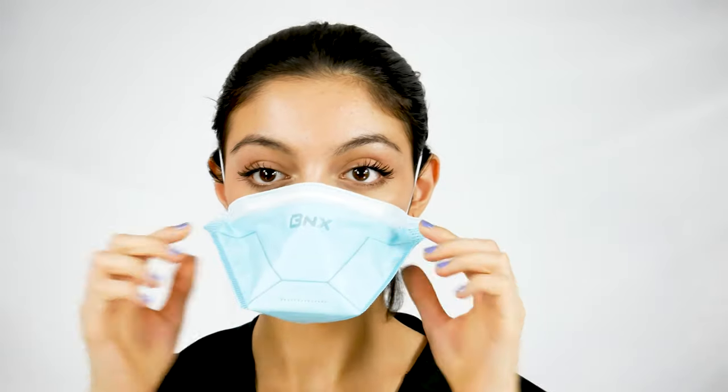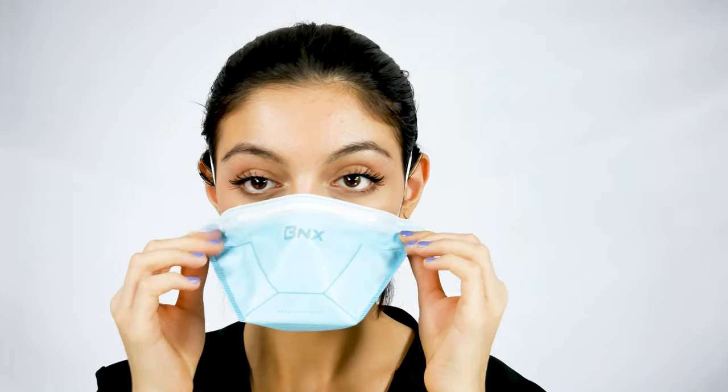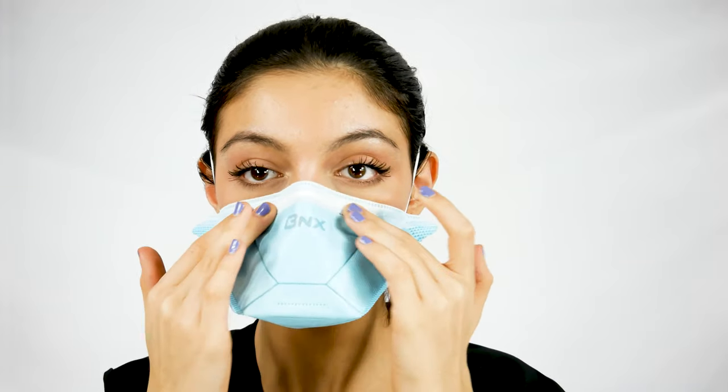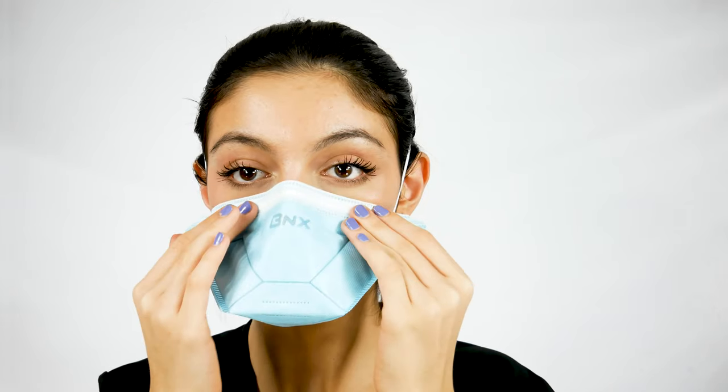Then straighten out the mask so it sits evenly and comfortably on your face and nose. Conform the nose piece to your nose. You can press it with your four fingers against the sides of your nose and cheeks.